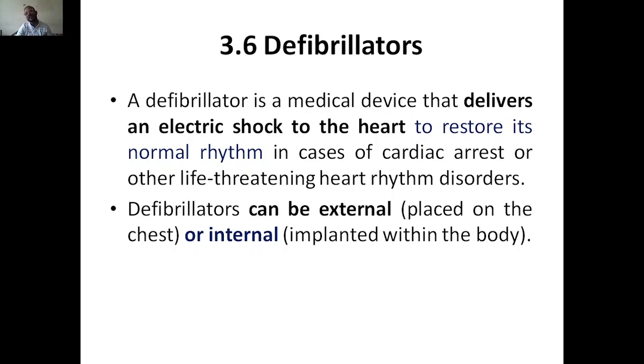Defibrillators can be external, that means from outside the body, or they can be internal also. Most probably it will be placed on the chest, so it will be external, whereas in some cases it is implanted internally within the body.